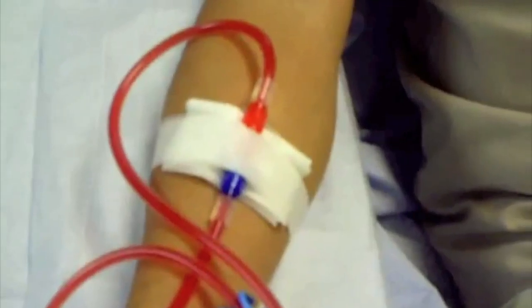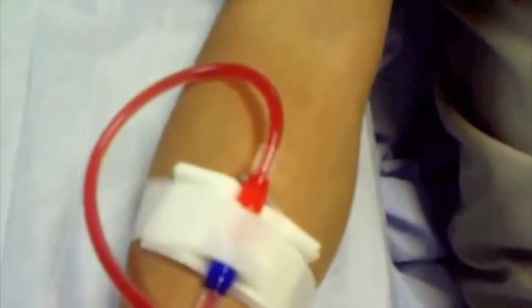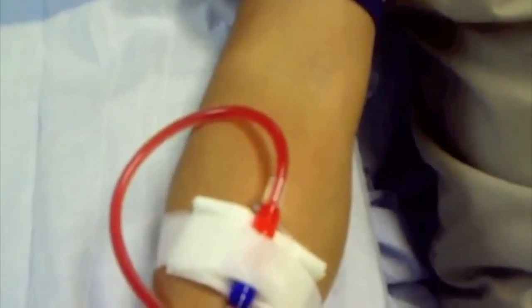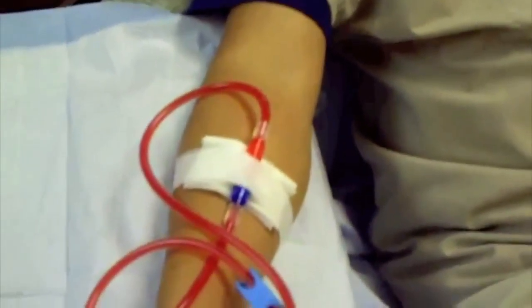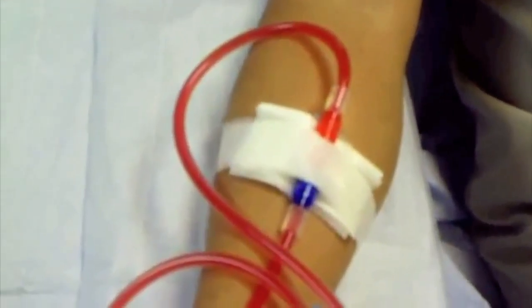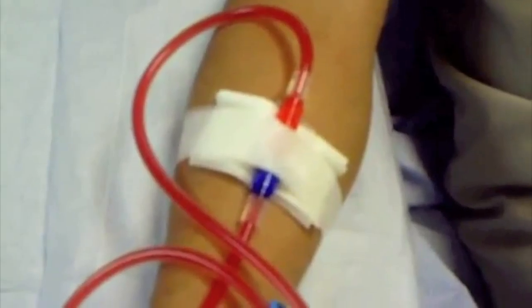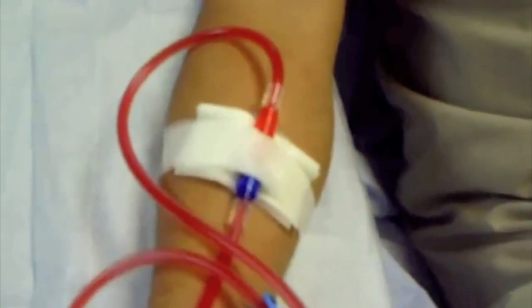A fistula is a more permanent access created surgically and is usually located in the forearm by joining, or anastomosing, an artery and a vein, preferably on a non-dominant arm. Needles are inserted into the vessels to obtain blood flow adequate to pass through the dialyzers.